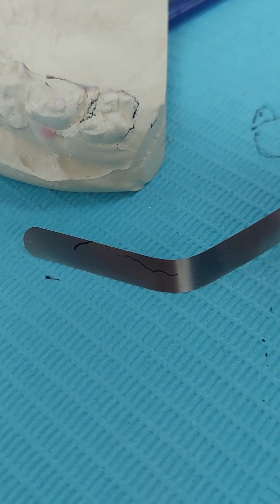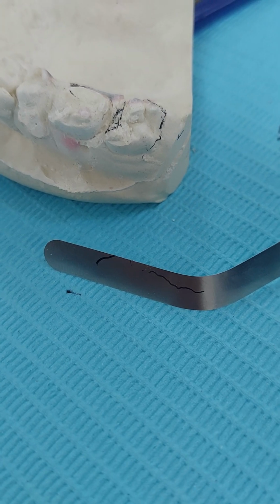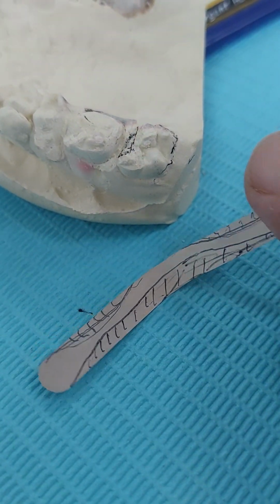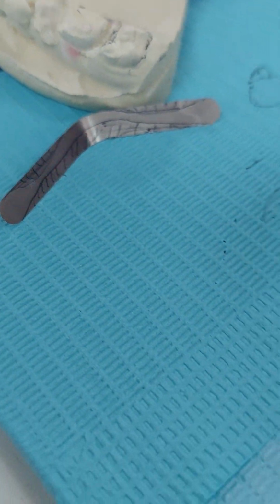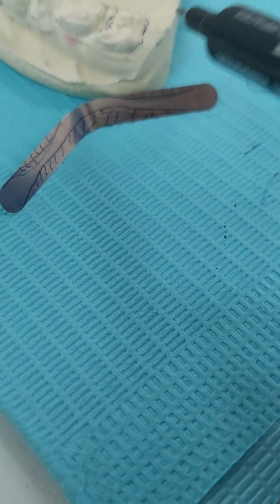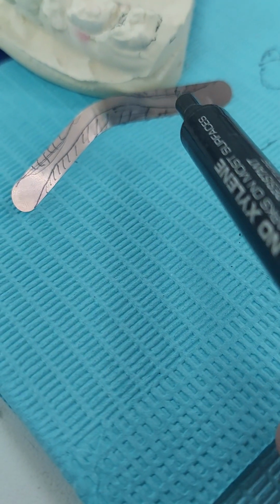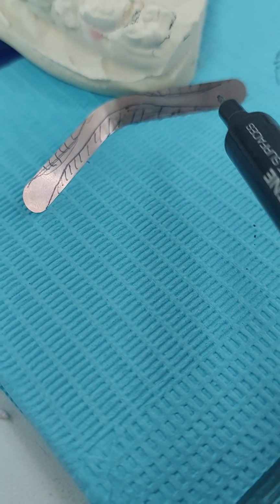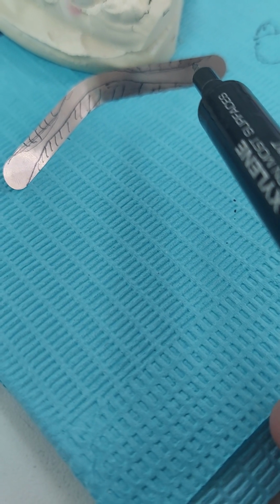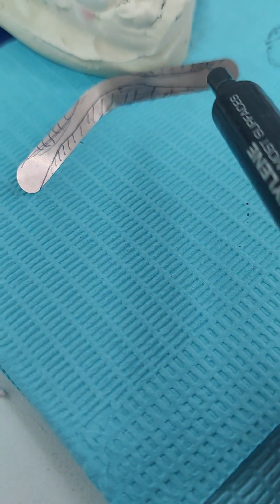Now the other technique is buying a specific deep gingival margin matrix. But we can make this matrix from the regular matrix. It is a pattern. If we cut this pattern from this matrix, you will automatically get a deep marginal matrix. So what is the pattern? We remove from this area to avoid the gingiva. We leave this thick because this is where the Tofflemire will be holding the matrix. We leave this area for holding with the Tofflemire. We remove this area to avoid the col here.